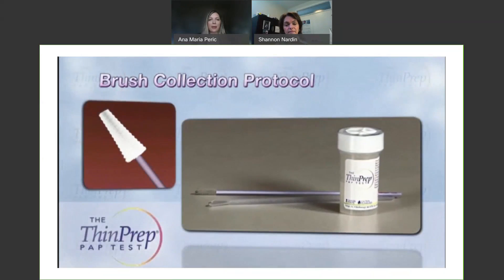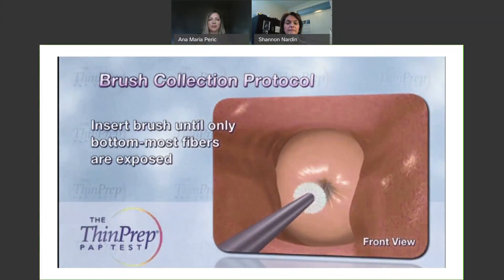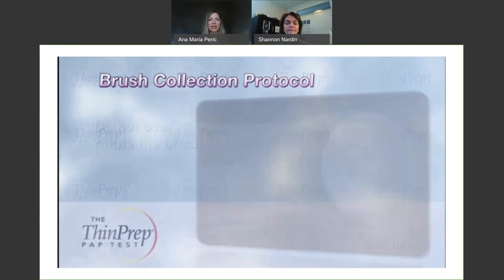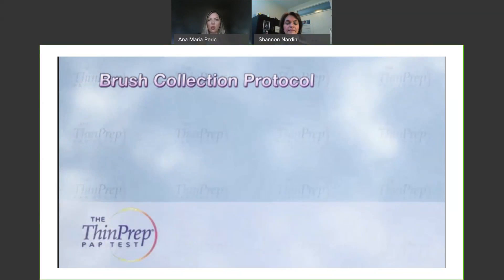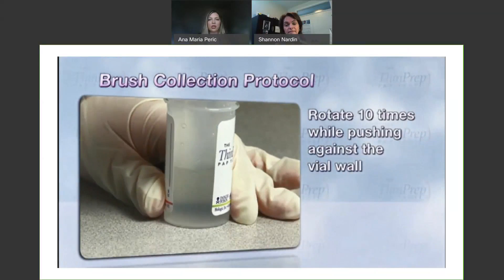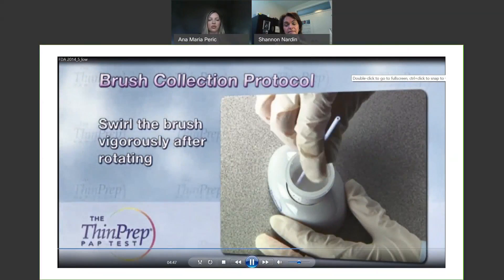Next, you'll go in with the brush. Insert it into the endocervix until just the bottommost fibers are exposed. Just a quarter to a half turn in one direction is more than sufficient, as over-rotation can cause bleeding and some discomfort for the patient, and it also doesn't give us any higher cellular yield. Once you've got that sample, swirl the brush in the vial, push it against the wall, and use the spatula if needed to help get all of that material off and into the liquid.